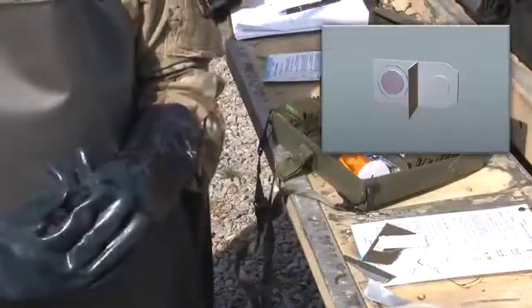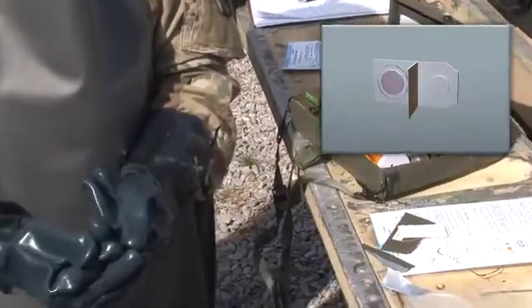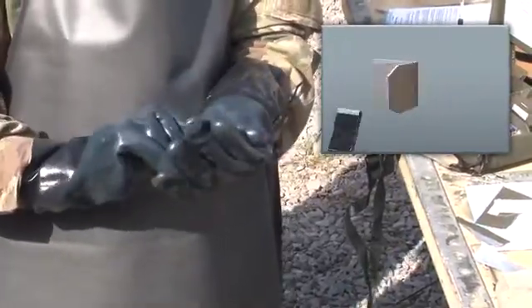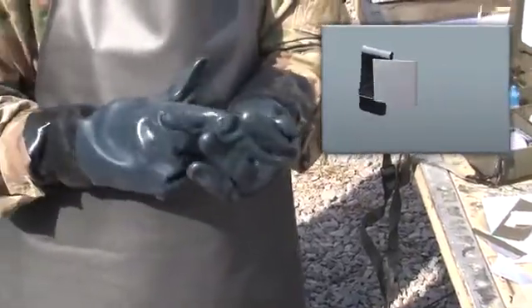Remove the metal clip from the kit. Then fold the silver cover back over the patch and fold the ticket so that the silver cover is inside. Insert the ticket into the clip.